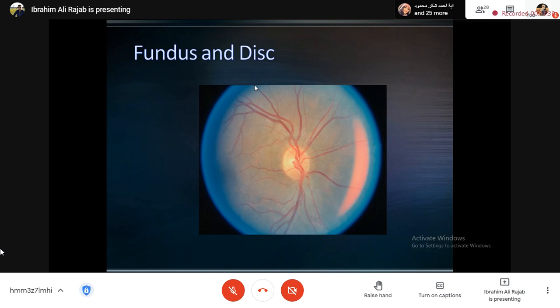نعم. يلا آية أحمد. آمنة قالت إنه we have a well demarcated optic disc وكلامها كلش مضبوط. فأنتِ راح تكملي لنا another description of this optic disc. Central cup and the normal neuroretinal rim. Yes. آية أحمد شكرا.